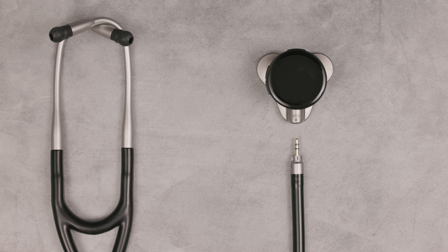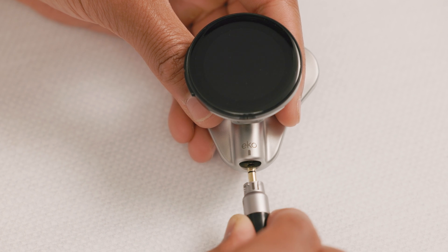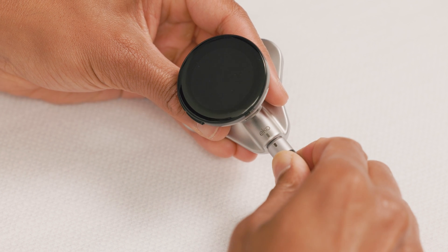First, let's attach the earpiece. The mark on the chest piece socket should align with the right side mark on the earpiece. Plug the earpiece into the Core 500, then twist the earpiece clockwise with a quarter turn until it locks.